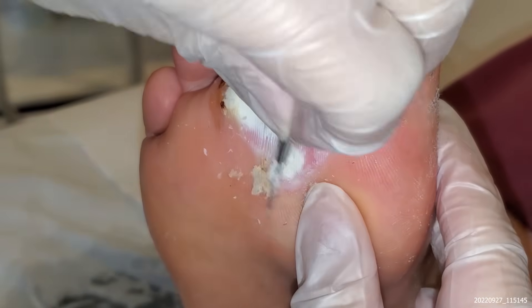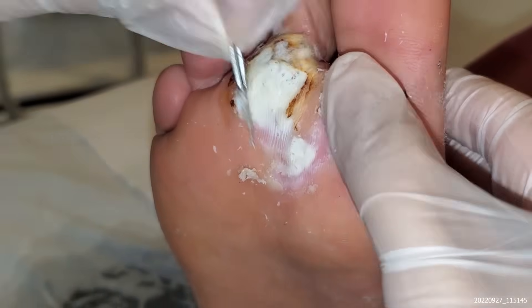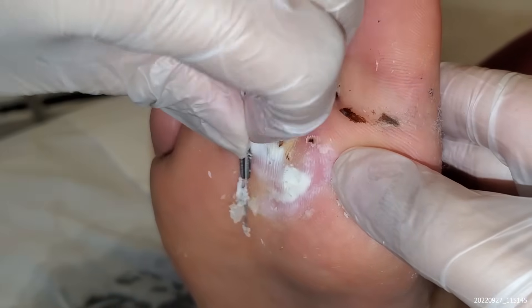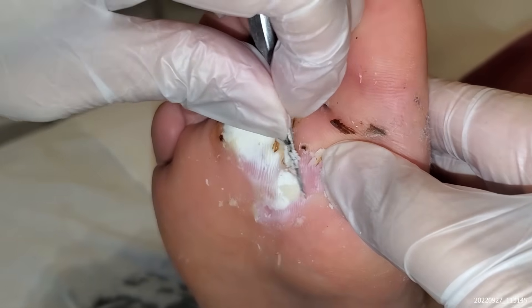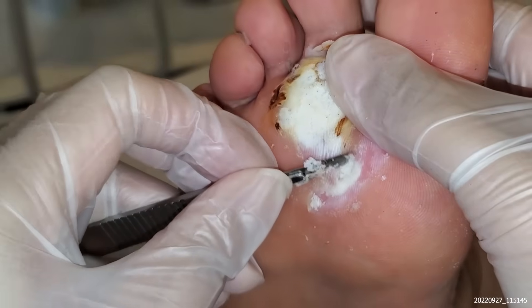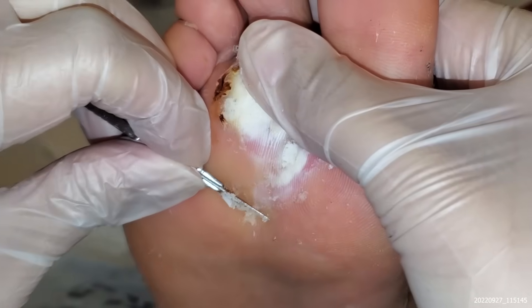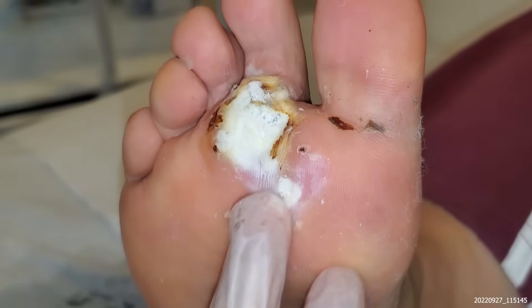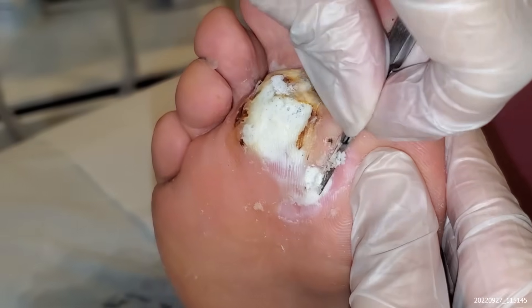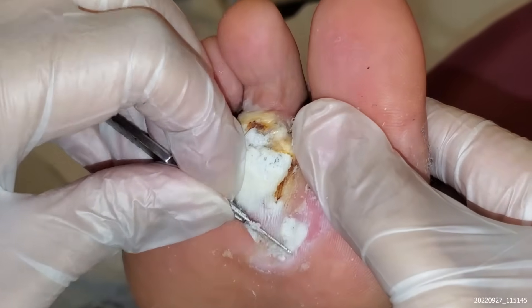We'll probably repeat the procedure again. It was quite tender last time when we tried to scrape a bit of it off — we had to stop. But actually now you can tolerate more of it off. There's still some here. You can see the black dot, which tells you how deep it is.